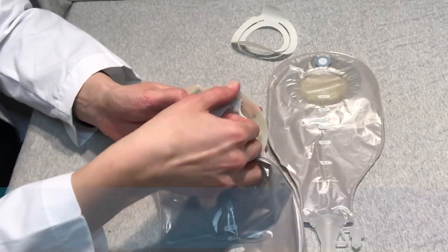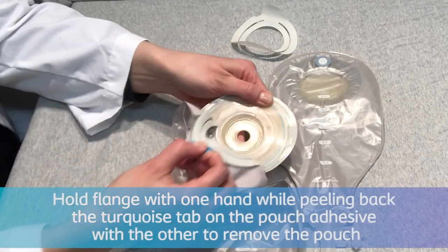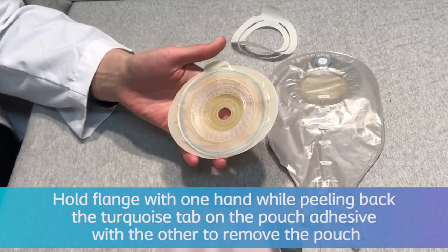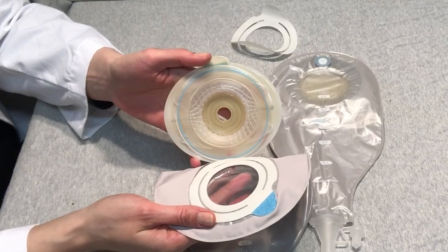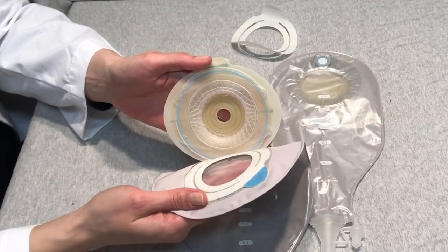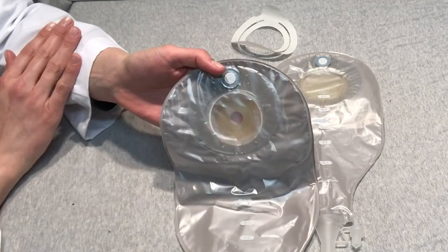And if you need to readjust, you can. You just pull in this blue tab. You can peel it off. Again, nice and clean and dry. Line up the back, the bottom, to the line on the bottom. And you can apply this way.